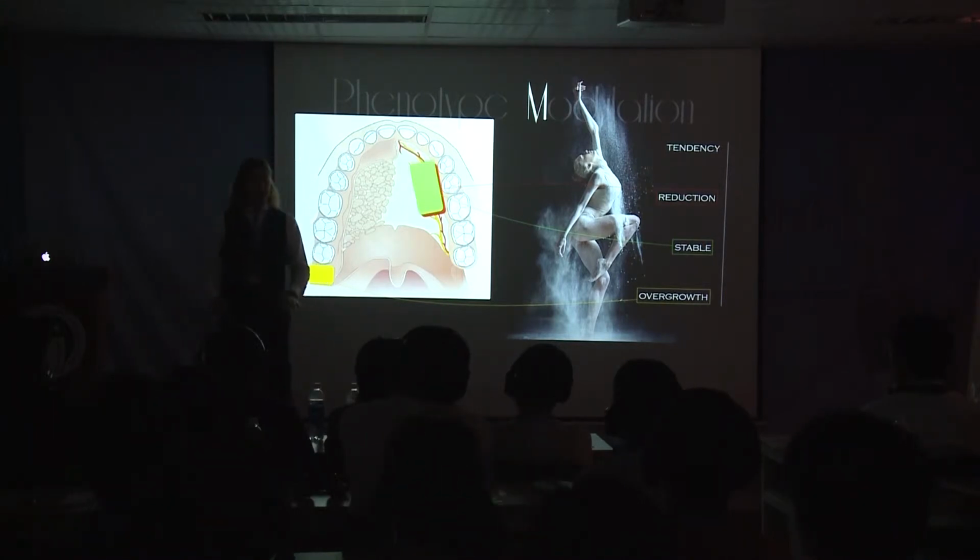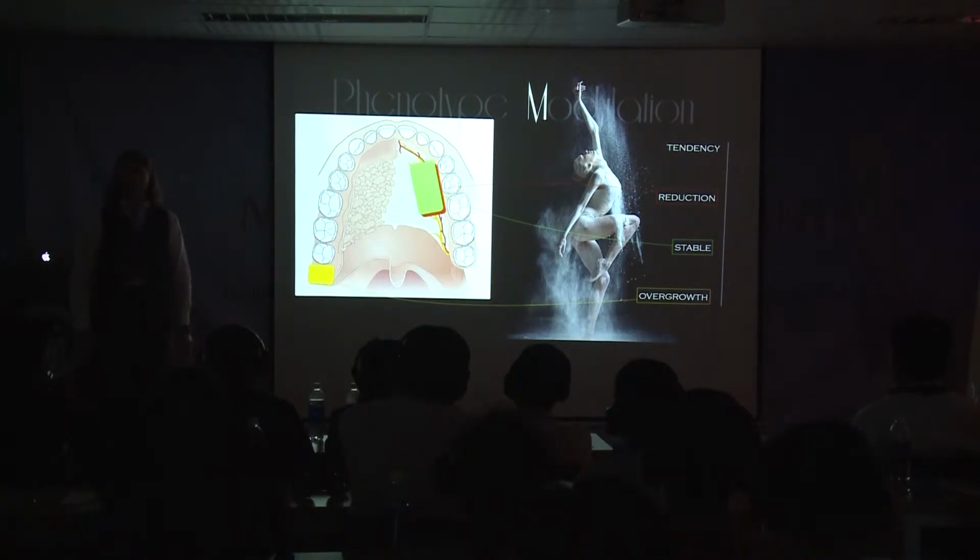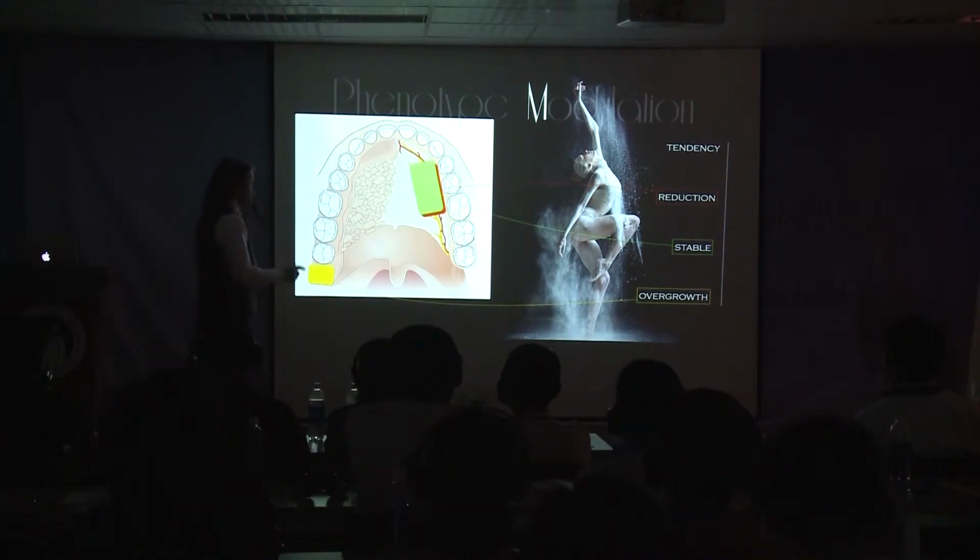You must not leave it exposed. The color is very white. And the tendency is to grow too much, unless you use it inside the receiving tissue. So it will express the tendency of overgrowth from the inside.